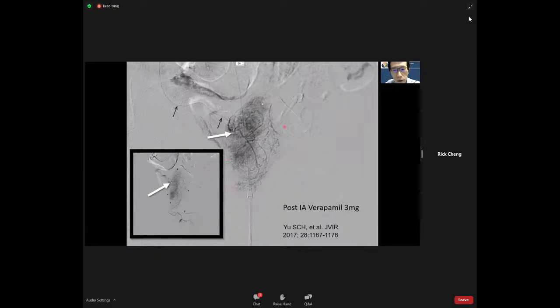By doing so, the vasodilatation in this territory leads to a pressure drop, and the flow from the penis would reverse and go into the prostate. So even with the DSA, the pressure would still be less than that in the penis, so the penis is no longer outlined. So this is effective.